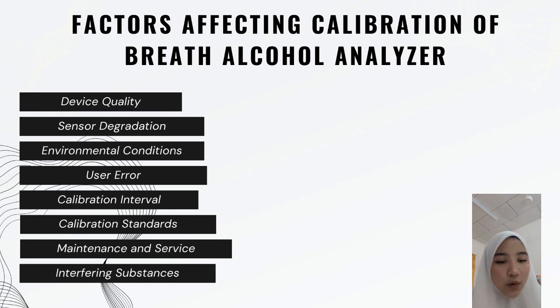First one is device quality. The quality and reliability of the breath alcohol analyzer itself play a significant role in calibration. Second is sensor degradation. The sensors used in breath alcohol analyzers can degrade over time, affecting their sensitivity and accuracy.